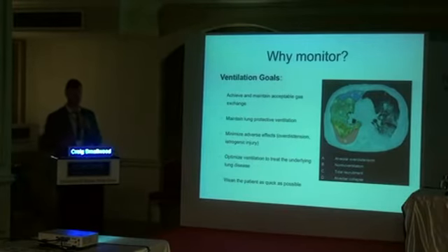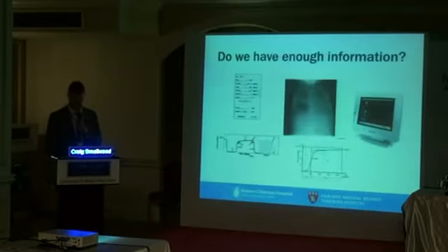And what we're really struggling with at the bedside is being able to identify these patients, because all we see is a tidal volume and an overall gas exchange. What we want to be able to do non-invasively, and not have to take our patients to MRI, is identify these inhomogeneities in lung distribution and target a therapy to ameliorate or fix that.